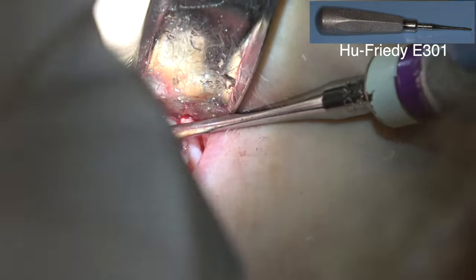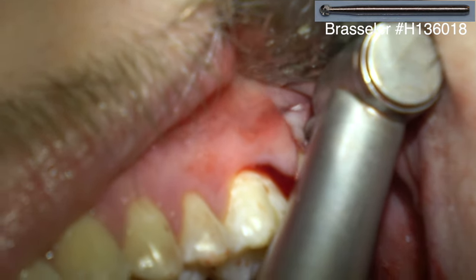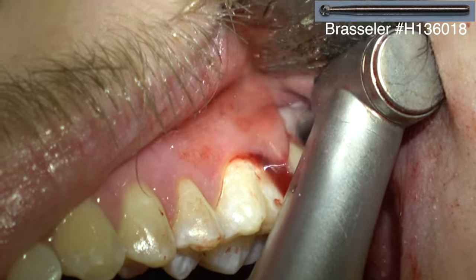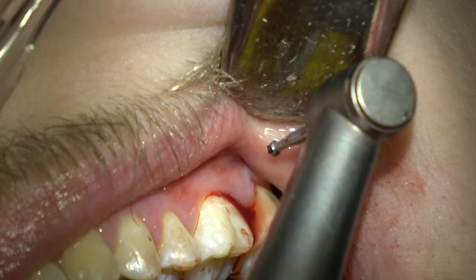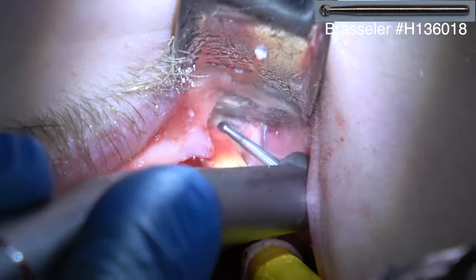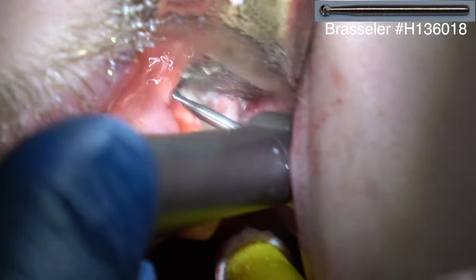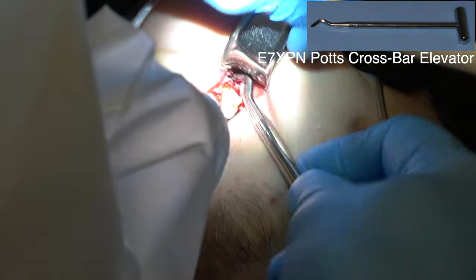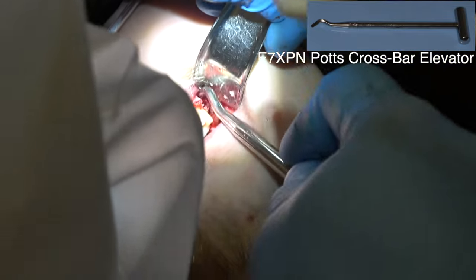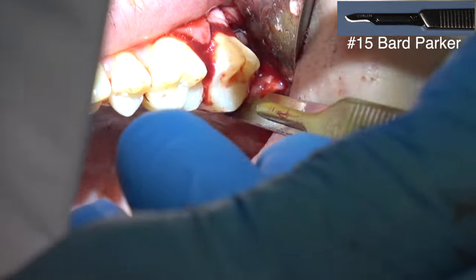Usually you don't need that distal space with a maxillary wisdom tooth because the bone in the maxillary posterior region is soft enough you can just elevate it through the bone. Now I'm trying to cut a hole into the tooth and use this instrument to torque it. Be sure you don't cut into the second molar. Everything on the left side if you're right-handed is harder than the right side because it's an awkward angle plus it's a tight space. I'm trying to gain a purchase point at about the CEJ so I can get an elevator in there and elevate that tooth.